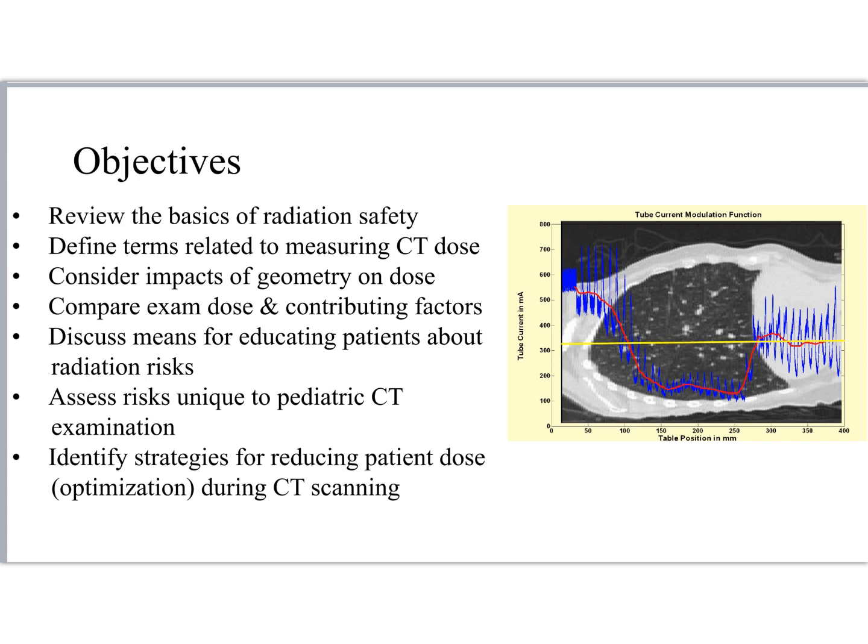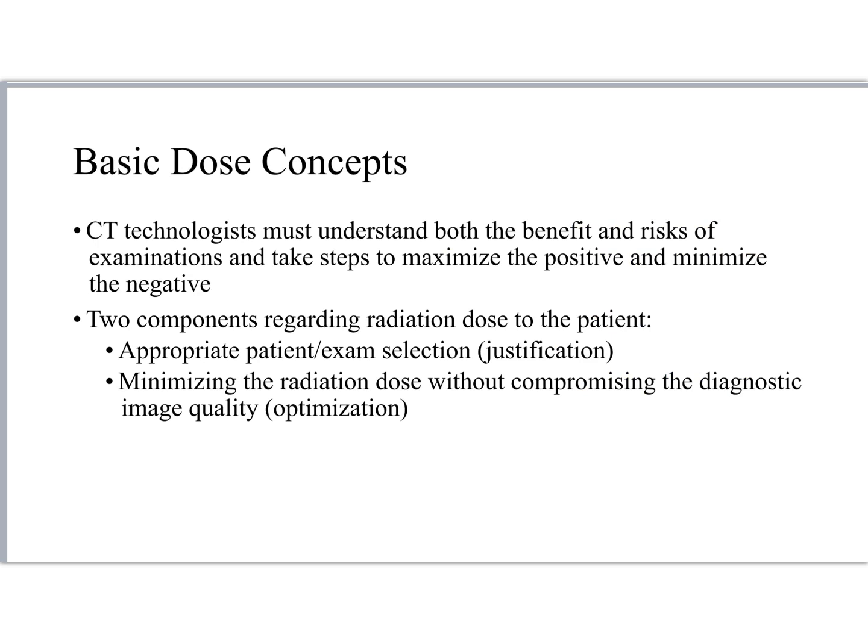So how does it plan that? Well, it plans it off of the initial localizer images, so the scouts or what have you, whatever machine you're working on, whether it's GE or Siemens, it works off of those localizer images in order to plan tube current modulation very often. And so sometimes technologists think, well, I won't do both localizers, that will save the patient some dose. But the reality is, oftentimes doing both localizers is necessary in order for tube current modulation to work best. So that is what I mean by how CT can be kind of counterintuitive.